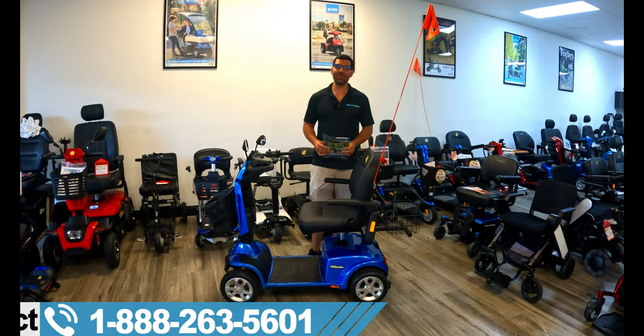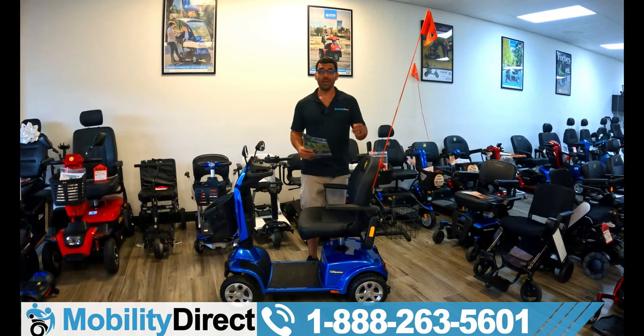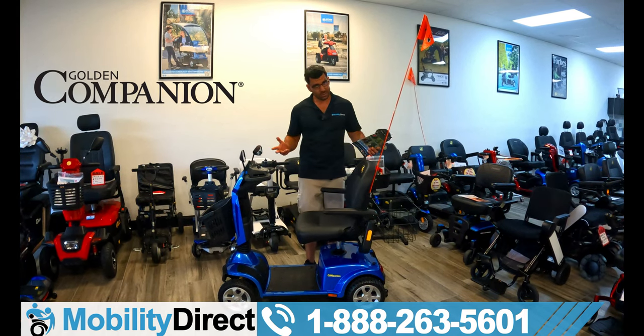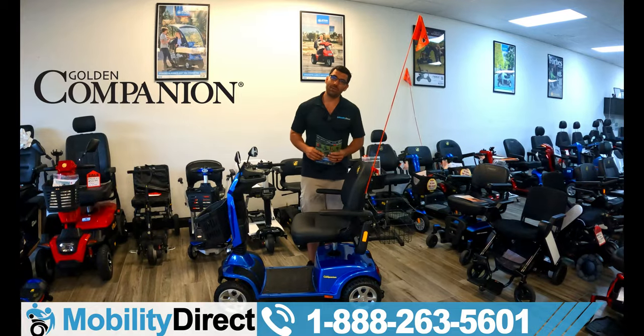Hi everybody, I'm Sergio with Mobility Direct. Welcome to our YouTube channel. Thanks for stopping by. In today's video, I'm going to tell you about the all-new redesigned Golden Companion four-wheel model by Golden Technologies. But before we get started, let's cue into some awesome action shots.